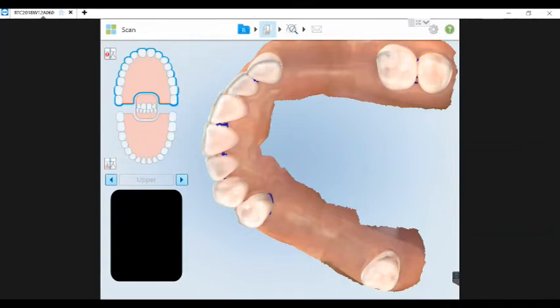And Brittany, I'll ask you your opinion. I mean, really, you can scan both ways. You can scan in color or you can scan in stone model mode. And it's designed that way on purpose for personal preference. Right. That's exactly what I was going to say. It's personal preference. For me, I enjoy scanning in monochromatic in the stone versus color. Because I'm a hygienist, it helps me not focus on how the tissues are looking and the health of the tissues or any buildup that I might be seeing. Yeah. Keep me on track.